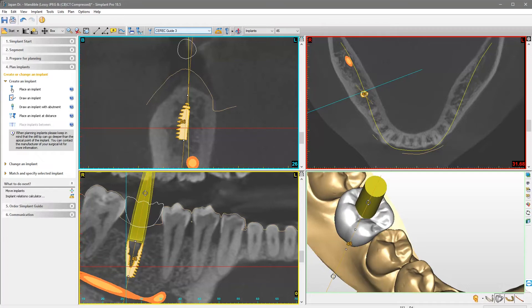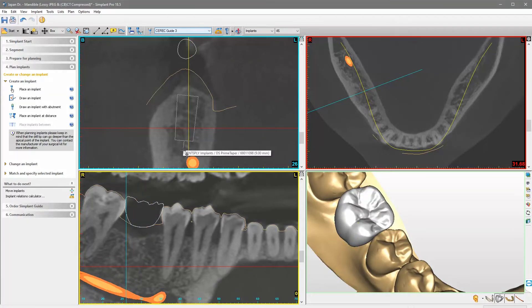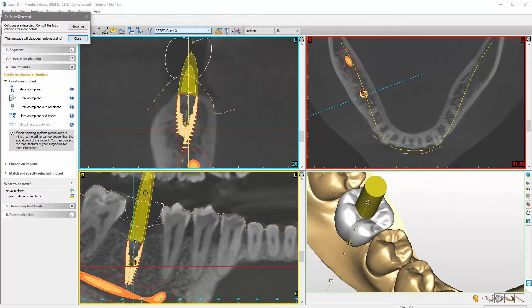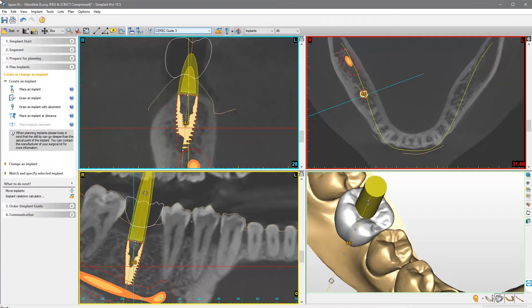When adjusting the implant position or length, the software will warn you automatically in case the implant is planned too close to the nerve. Make sure the collision detection tool is activated. We undo the modification of the length.